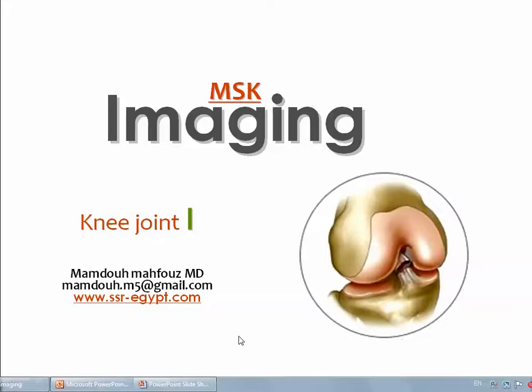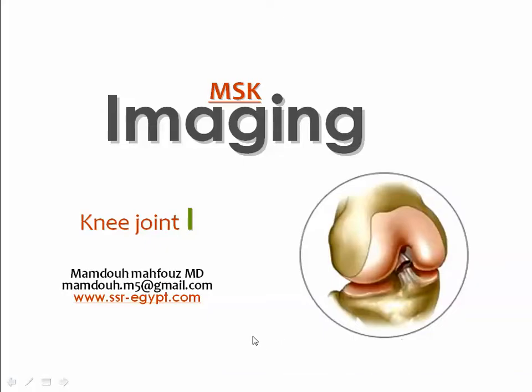Now we'll start by the imaging of one of the famous and commonly seen joints in the clinical practice, which is the knee joint. And we will handle the knee joint in two lectures. The part one will be about the meniscal imaging and the ligamentous pathology, and part two will cover the remaining issues in the knee joint.